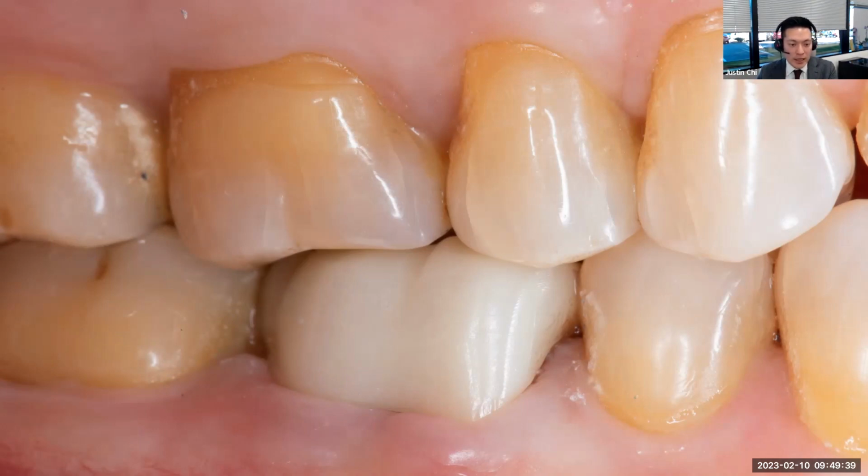And so that's what we did here, nicely polished. And I think this blends in. It does fit what we were trying to accomplish, improving the patient's form and function. And then the aesthetics, really, once you position the tooth well with the adjacent teeth and the opposing, the aesthetics just kind of fall into place.